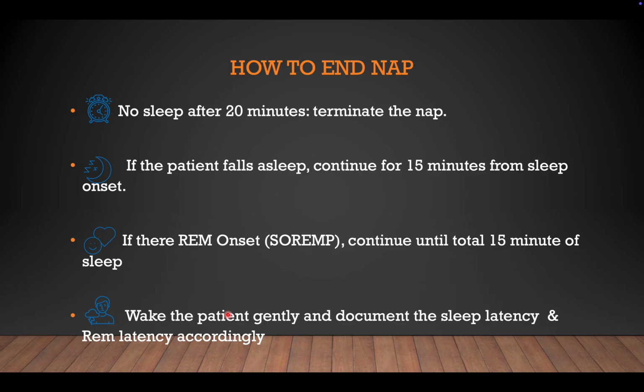There are no correct guidelines. There are some arguments that once we have a REM sleep onset, we need to immediately wake up the patient, but there is no correct recommendation. The generally accepted rule is to continue till 15 minutes. Wake the patient gently and document the sleep latency and REM latencies accordingly, as given in the previous documentation form. Now, we have completed the first nap.